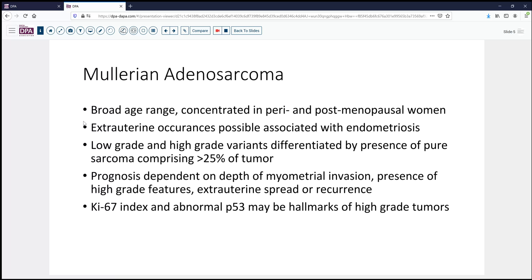Both high-grade and low-grade variants are possible. Our case today is a low-grade variant, but the high-grade variants typically have greater than 25% evidence of a more sarcomatous overgrowth type of pattern.